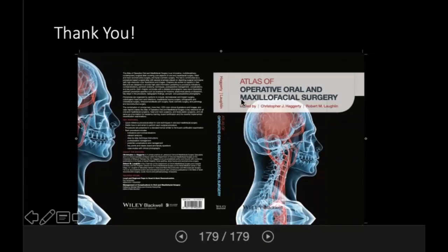Whenever I've placed 4 implants in the mandible in an appropriate position with some posterior load, I've never had a patient come back and ask for a 5th or 6th implant. So again, with that patient, I take out the 6 remaining teeth, not place any additional implants, give her a locator-supported prosthesis or a fixed hybrid prosthesis if that's what the patient was looking for.